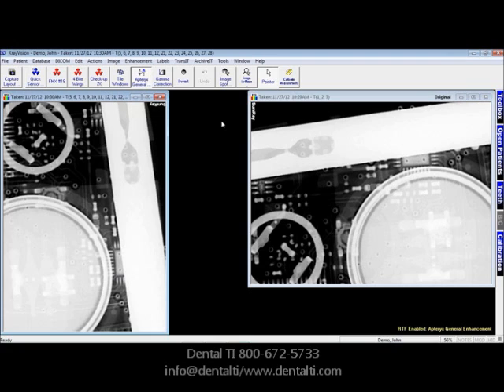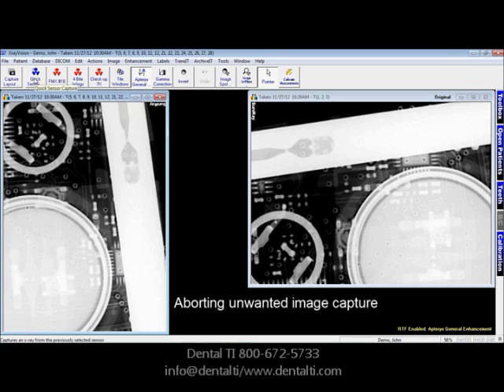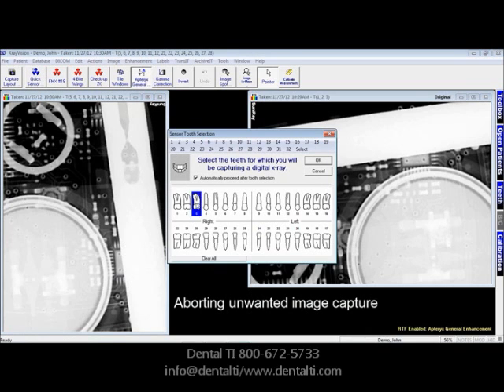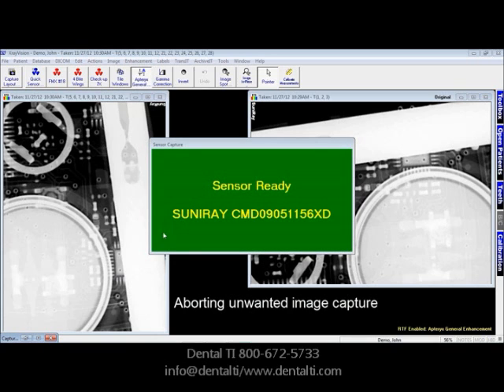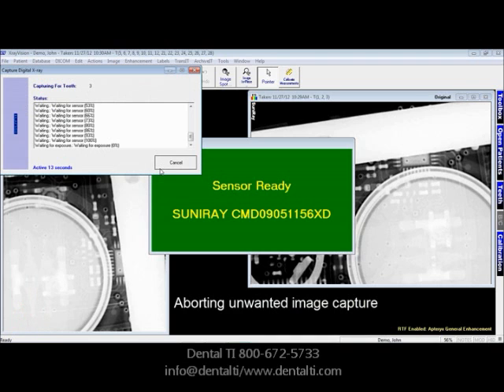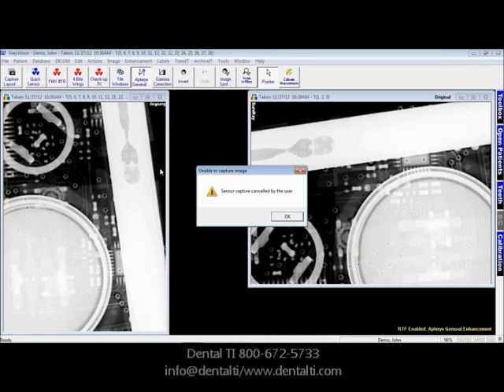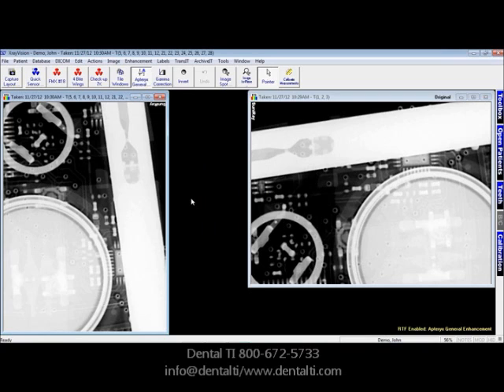We'll also cover how to stop image capture. If you've selected Quick Sensor and selected your tooth number and want to cancel the capture, come down to the sensor capture box, restore it up, and simply click Cancel. That will cancel the exposure. Click OK on sensor capture canceled by the user. That covers capturing single X-rays into X-Ray Vision, as well as stopping series capture and deleting individual images.